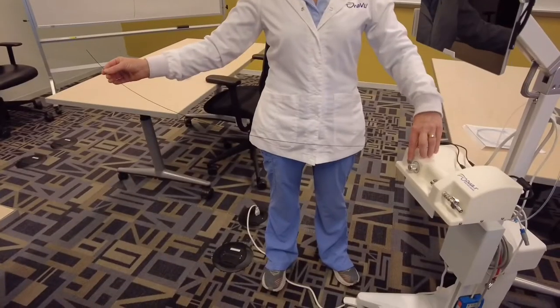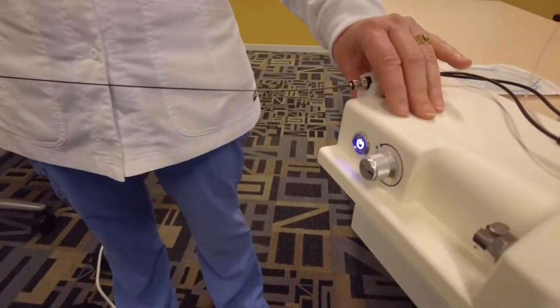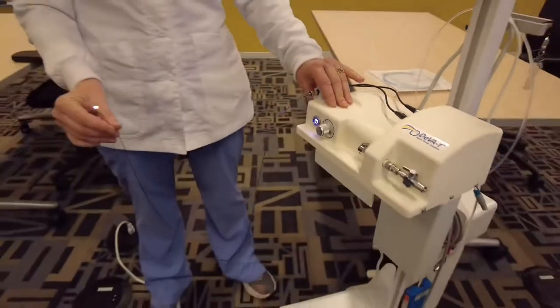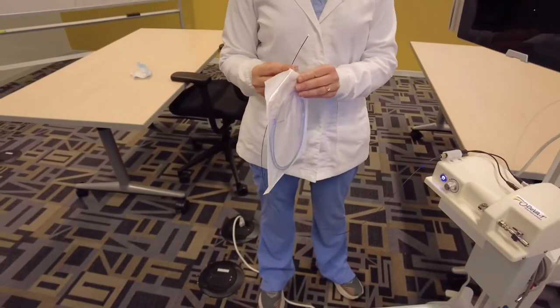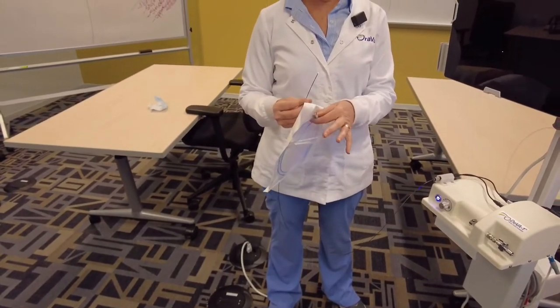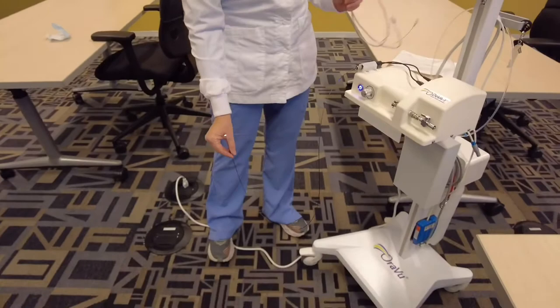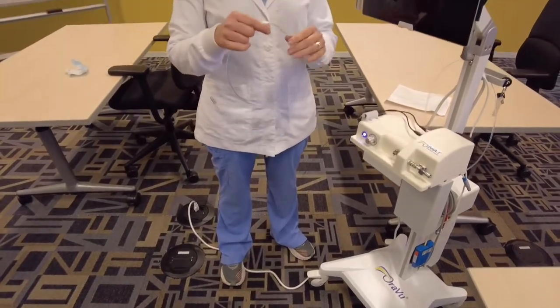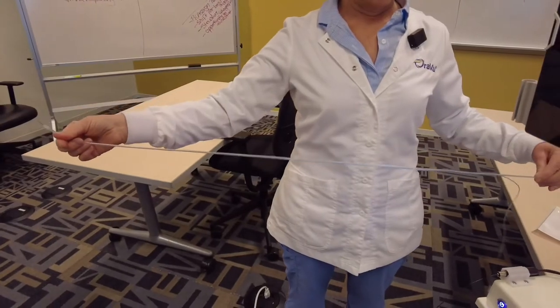Holding the fiber, I suggest you turn the Diva on so you have light at the tip of your fiber, and then open up your sterilized sheath. Once you pull out your sterilized sheath, you want to stretch it out a little bit to make it nice and long.